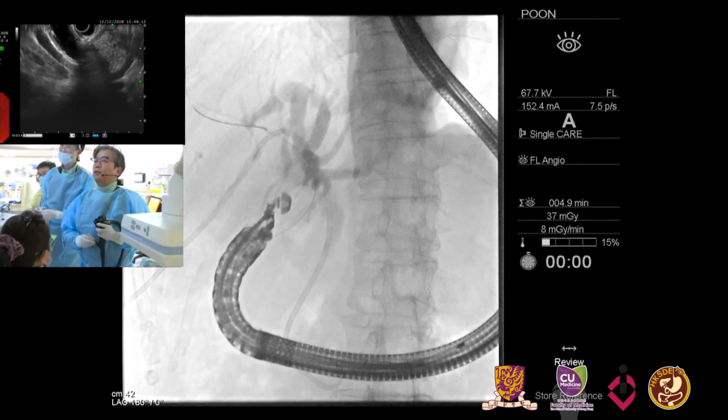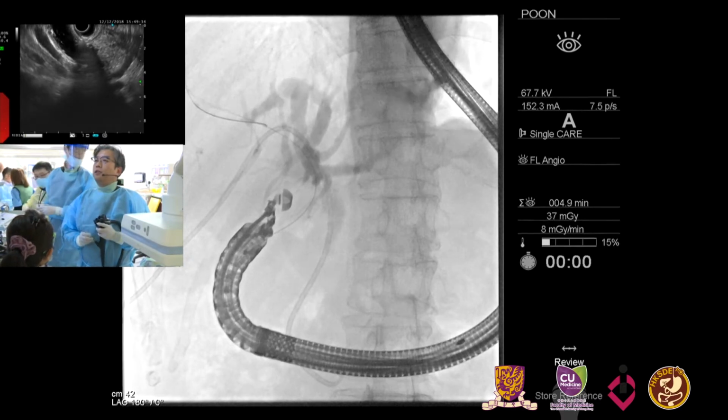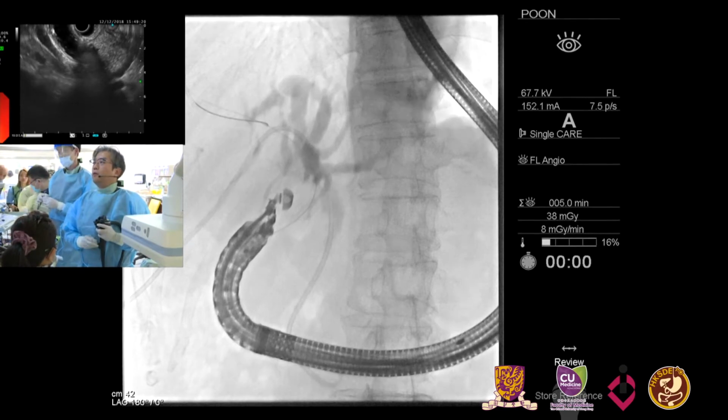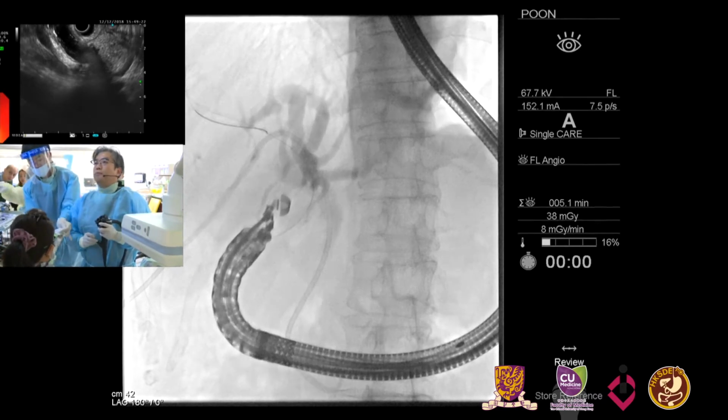Yes. I use a six centimeter length, 8 millimeter diameter stent. That was very nicely done.